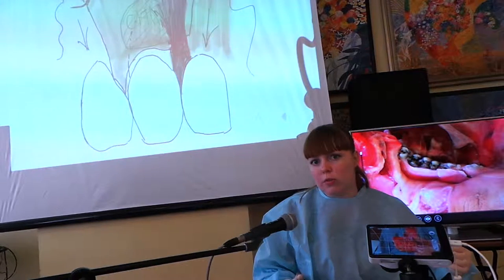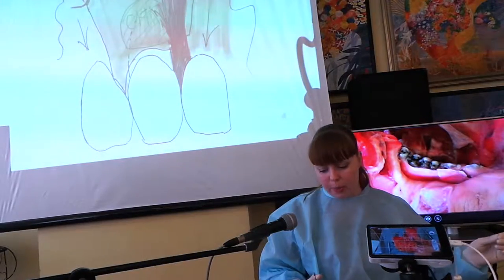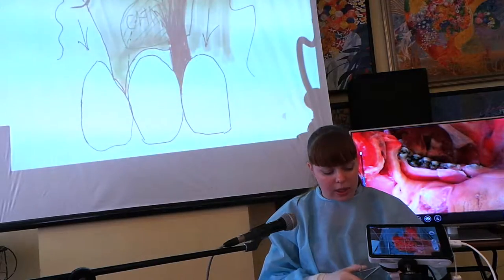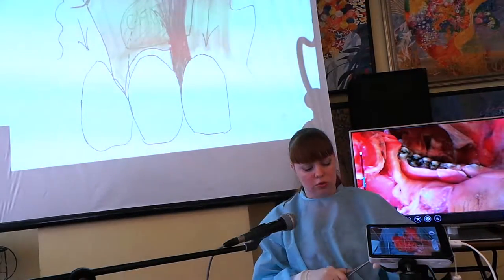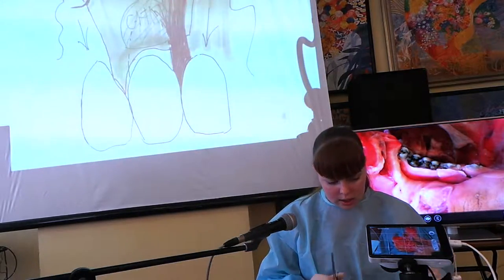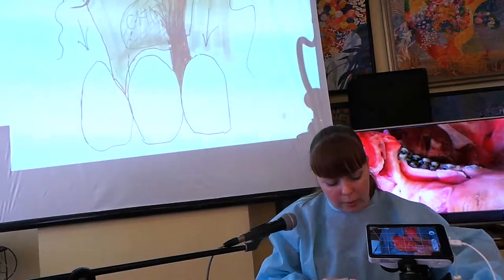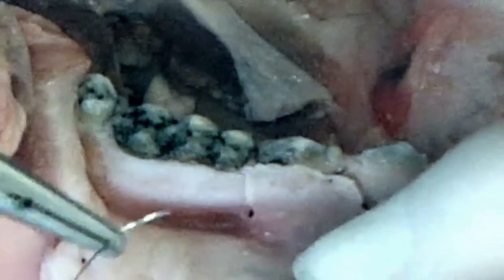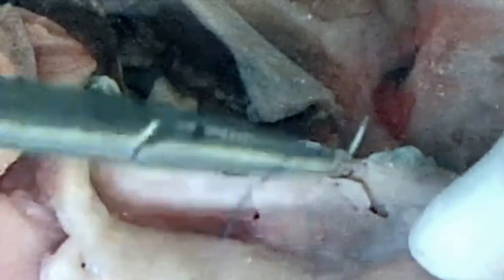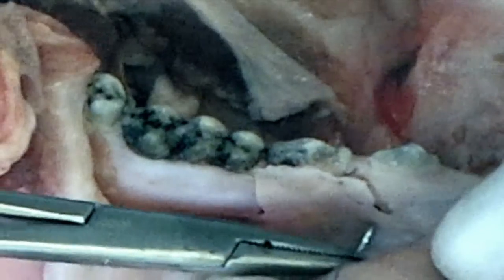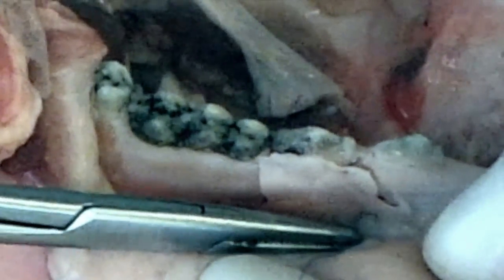Теперь мы выполняем очень важную манипуляцию, которая будет прогнозировать клинический успех и отсутствие рецидива, такого как расхождение швов или обратная редукция апикального слизисто-надкостничного лоскута. Фиксация мобильного слизисто-надкостничного лоскута проводится в самых апикальных точках трапециевидного вертикального разреза с захватом надкостницы.